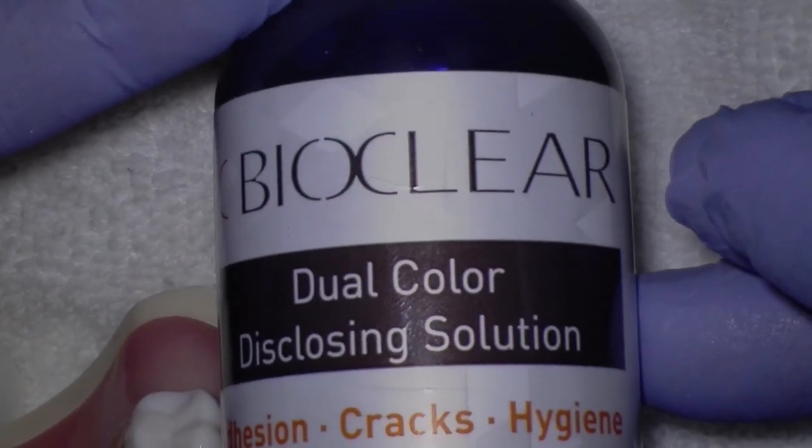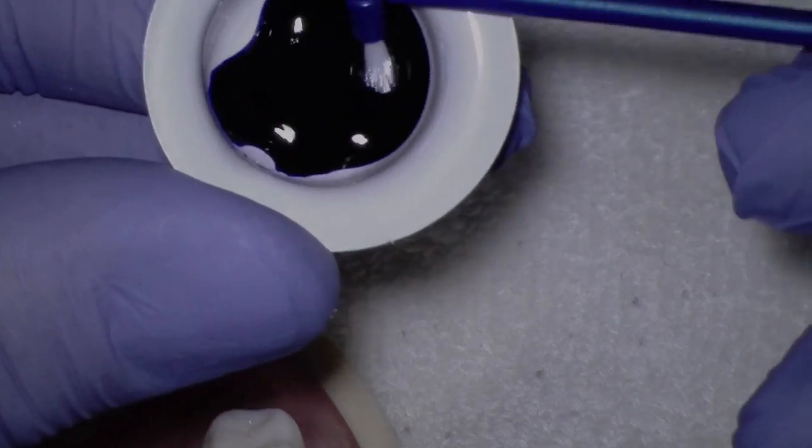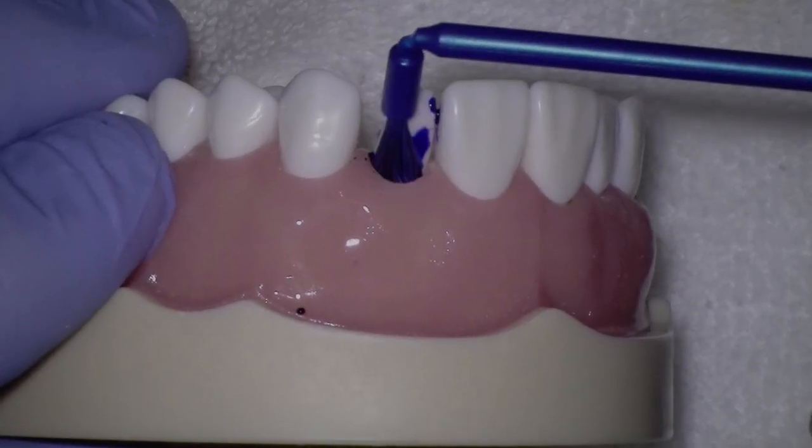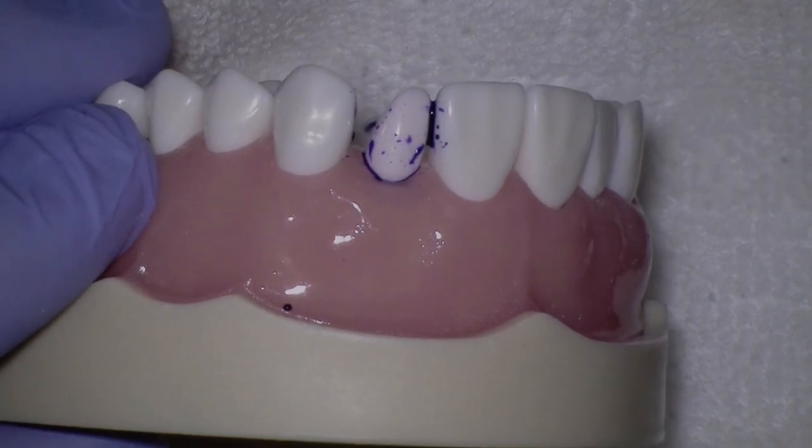So here I'm using the Bioclear dual color disclosing solution. Now, of course, we're not going to have much biofilm on a dentiform tooth like this, but we still want to go through the process to demonstrate the steps.